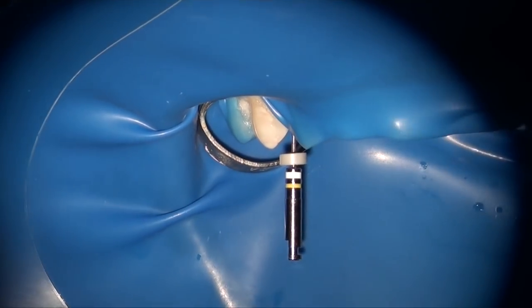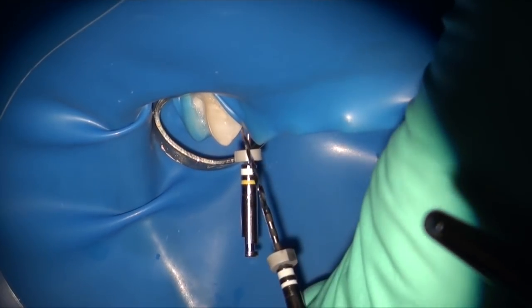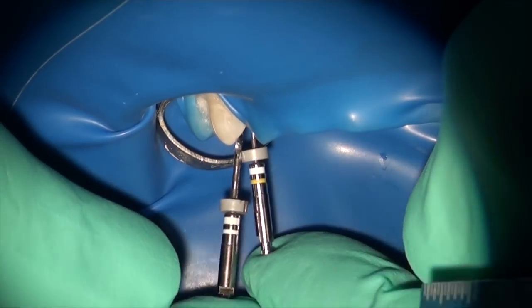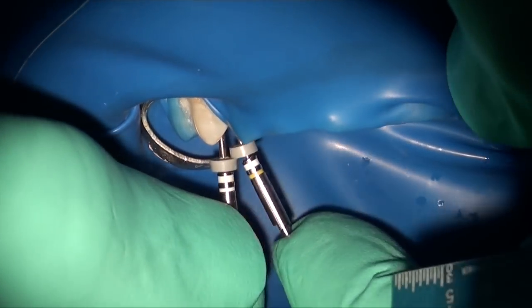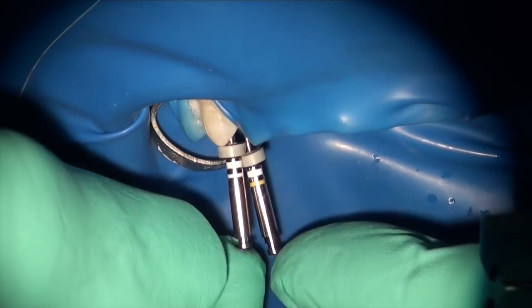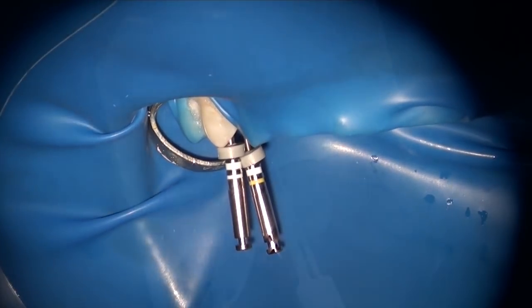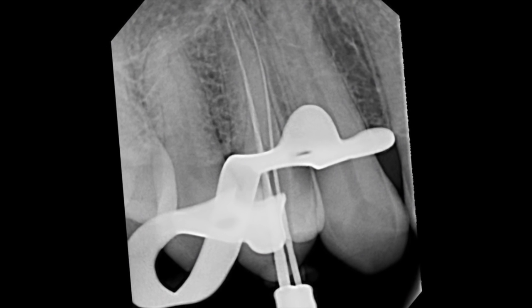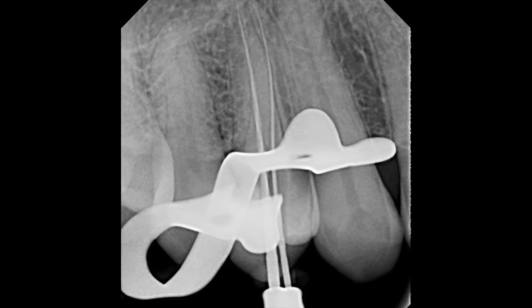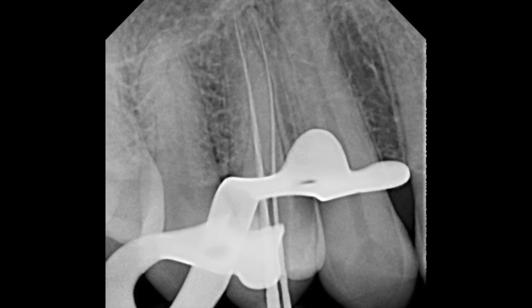On the buccal, it was a fairly large canal and my expediter actually already fit to the full working length. I'm now proceeding to use the expediter on the buccal and the 1502 on the lingual, and I take a confirmation radiograph that shows both the expediter and the Scout 1502 have reached full length on both the buccal and lingual canal — we're basically ready for instrumentation.